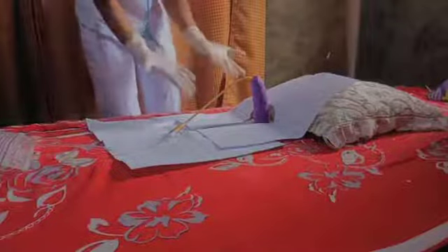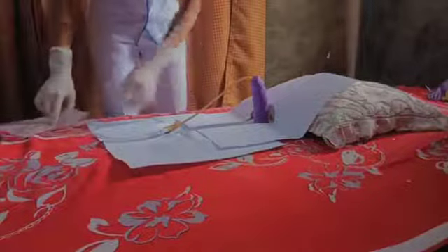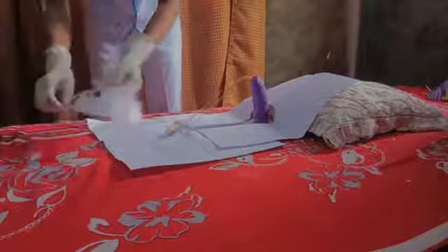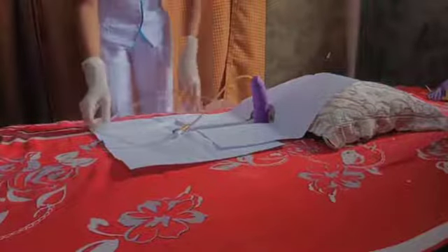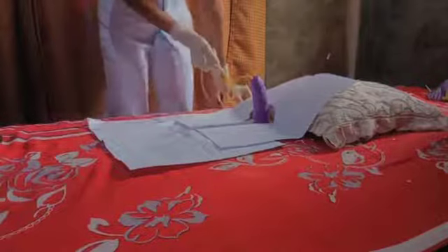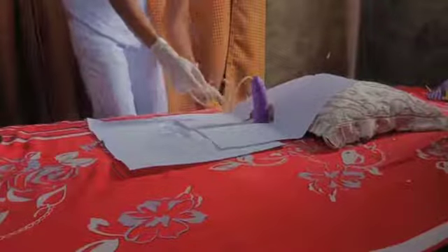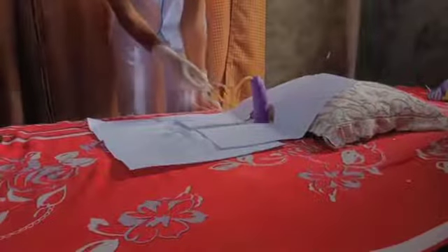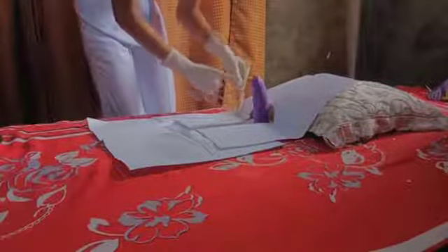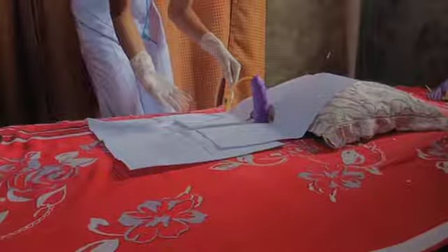Now that we have successfully inserted the catheter, we will place our collection bag below the hip to prevent ascending backflow. We also tape the tubing at the inner side to prevent tension on the urethra. Place the bag below the hip at the bed frame — not at the bed rail, because the bed rail tends to move. Tape at the inner side because it is less mobile and more comfortable for the patient.